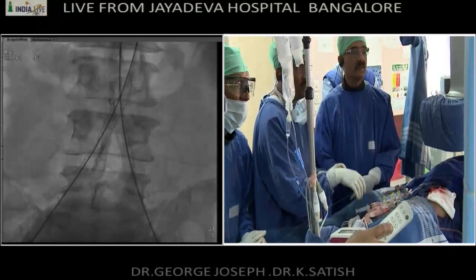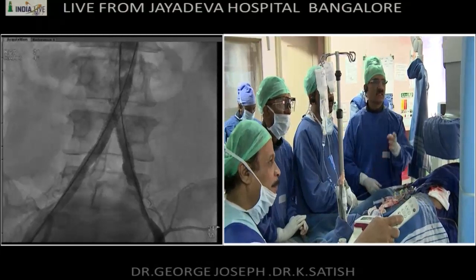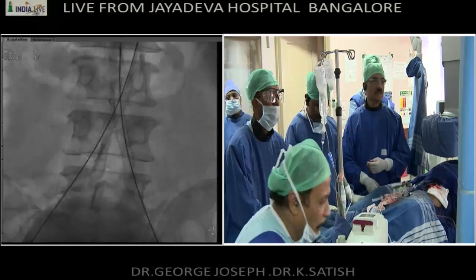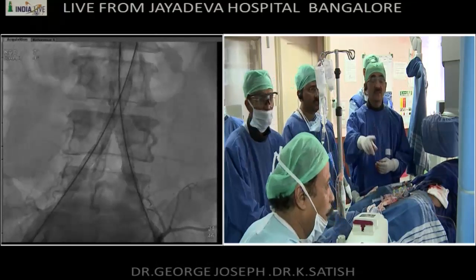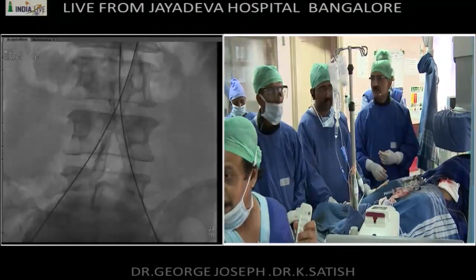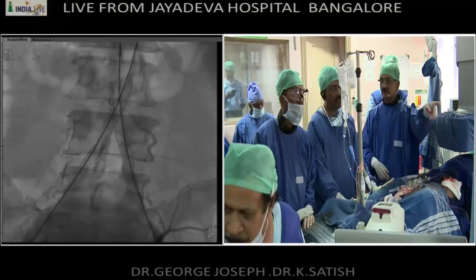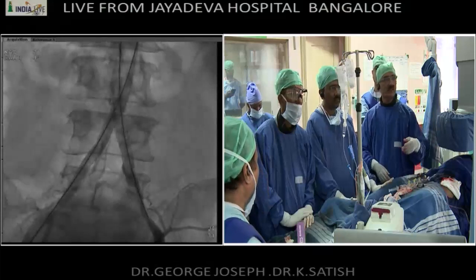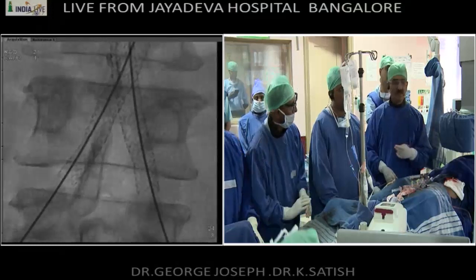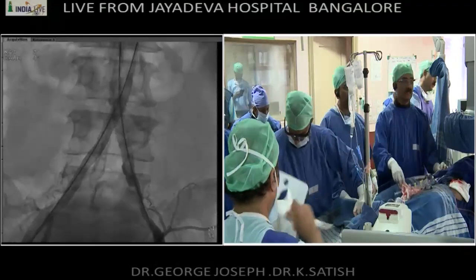I think the left side definitely needs an additional stent. So can you get us a self-expanding 880 or 860? Okay. No, self-expanding. No, we've already put an 8, so I don't want a smaller one. Okay, 880 is fine. We can overlap. So I'm going to extend the left with a self-expanding 880.